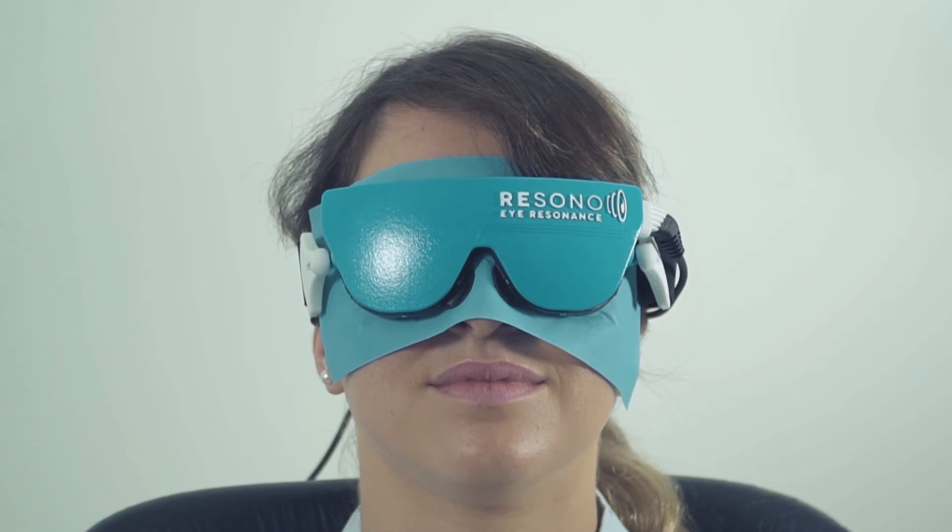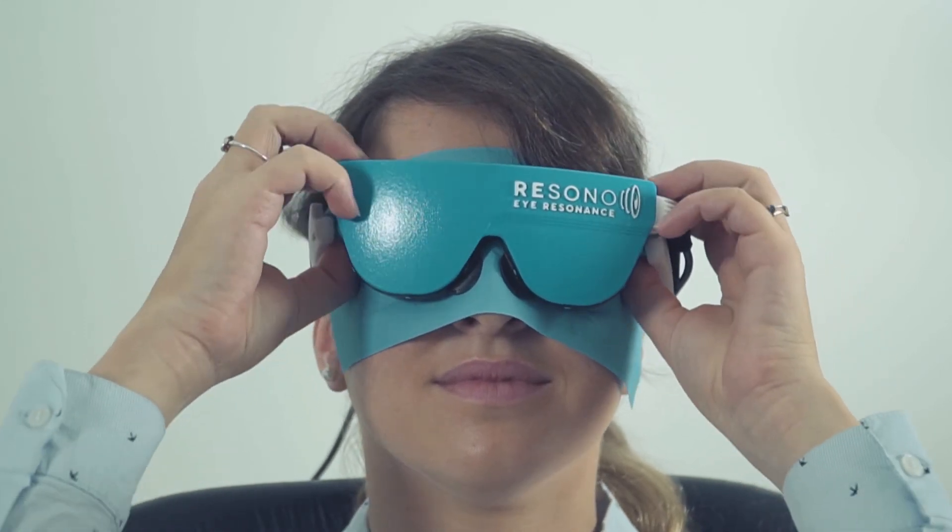As mentioned before, the patient may complain of blurred vision, which will resolve in a few minutes. This is not due to any electrical event, but simply to the pressure onto the eyeball.